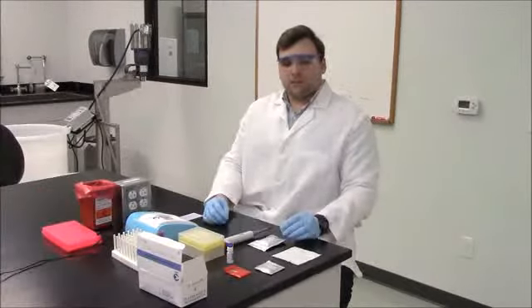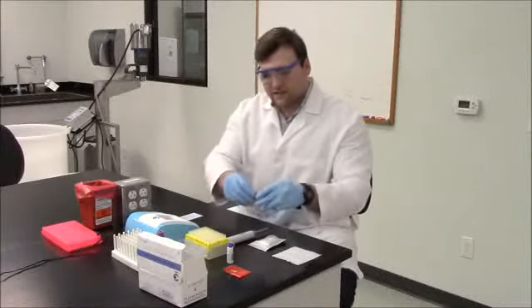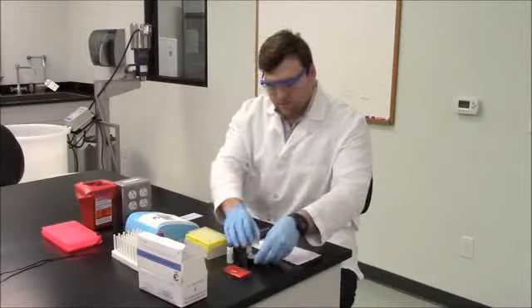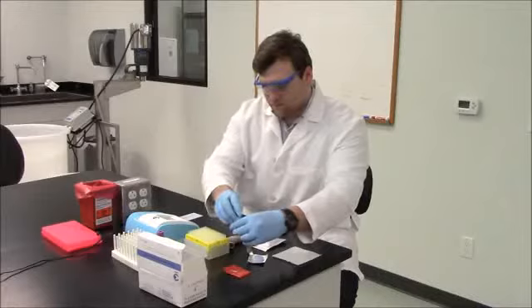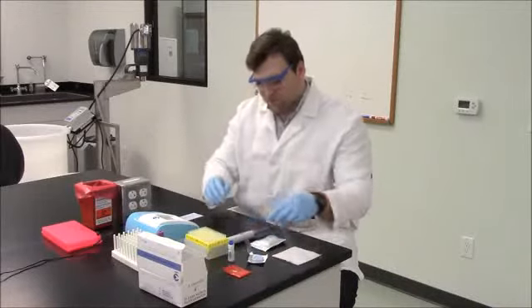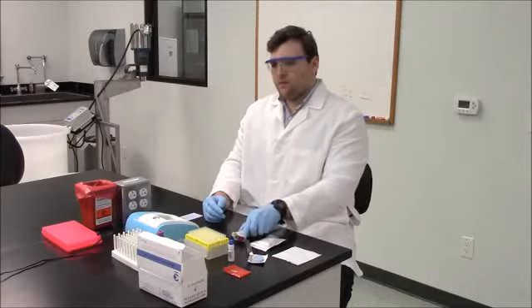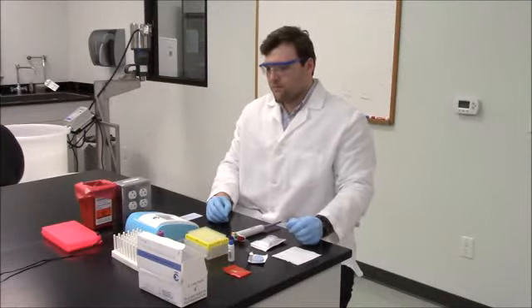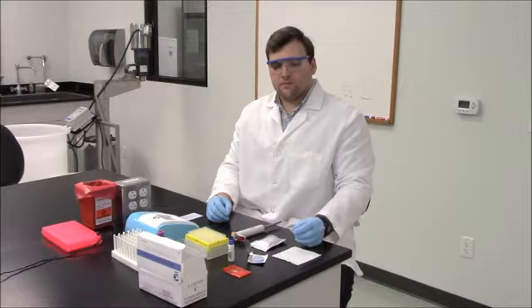While the sample is incubating, we can prepare the testing disc and reagent tube. After the incubation is completed, mix R1 well again. Apply 25 microliters of mixture to the cartridge. Don't touch the cartridge. Avoid air bubbles.